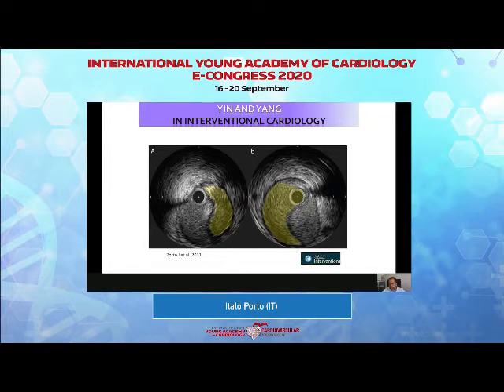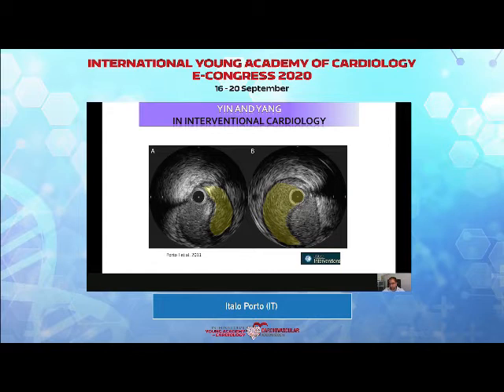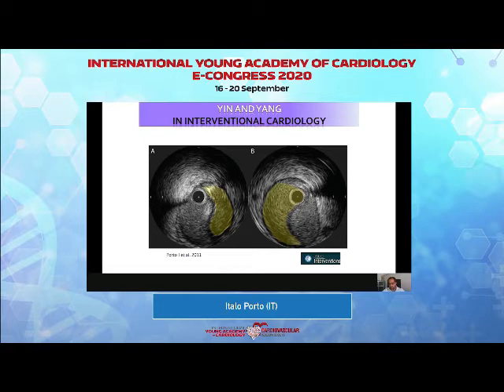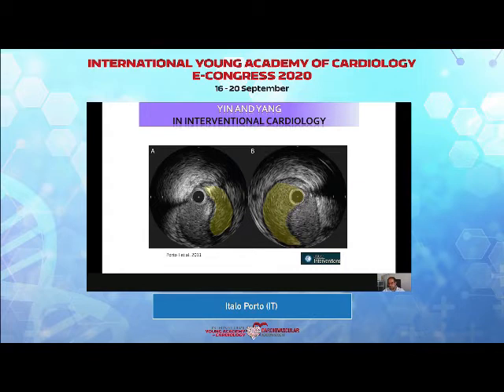In this IVUS picture, we can see that the IVUS probe and wire are in a lumen which is not the true lumen. You can clearly see that the external elastic lamina — this black membrane which differentiates the media from the intima — is continuous in one lumen but not in the other. So the probe is in the false lumen. By manipulating the probe and wire, we can gain the true lumen. This is a very important use of IVUS to differentiate true from false lumen, and is extremely useful in CTO interventions.